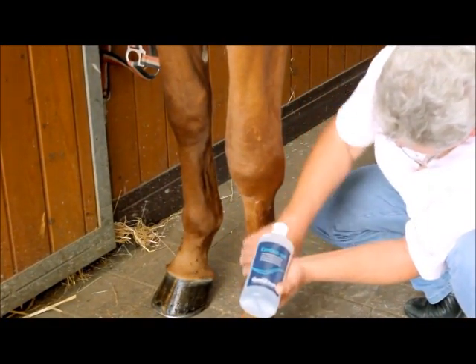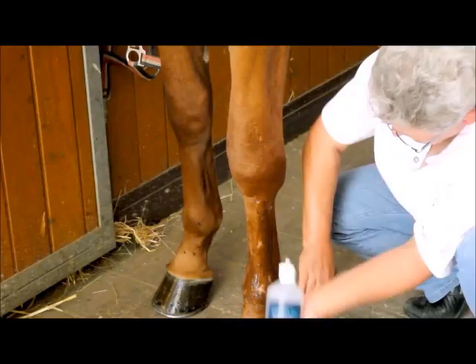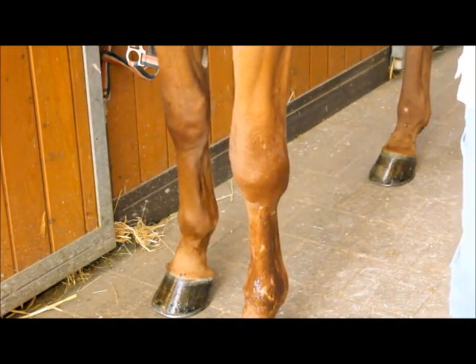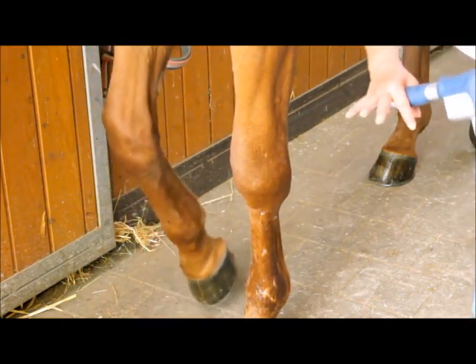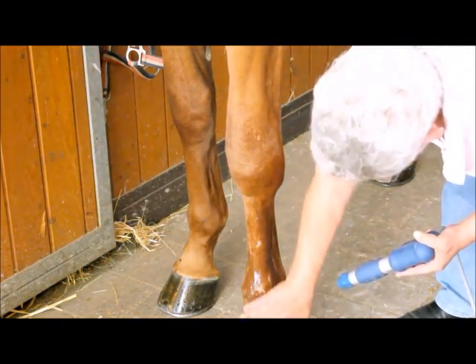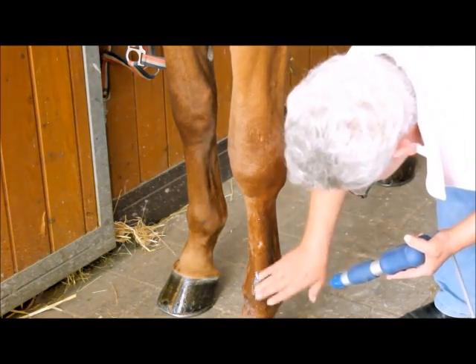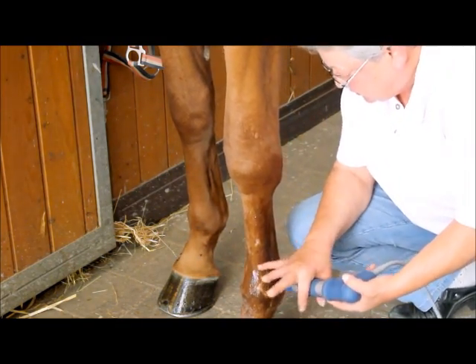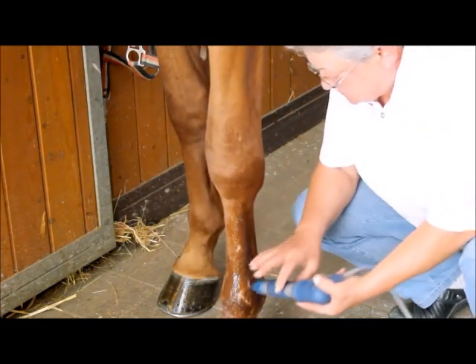So what do you think about the success of the therapy? Do you think it's a very good support to your horse physiotherapy? Absolutely — in combination it's absolutely not only a good tool. You can use it especially on tendons.